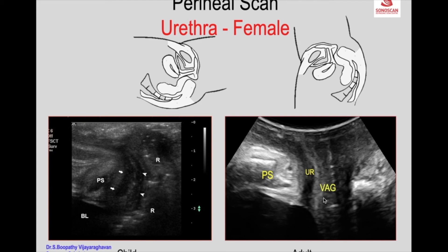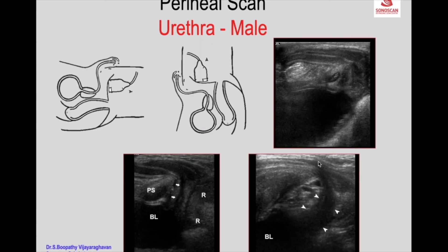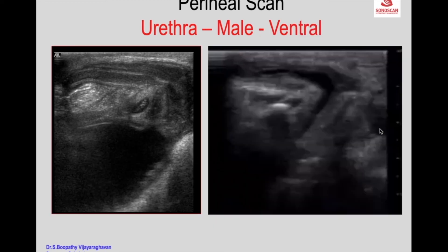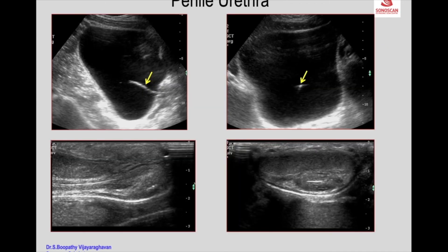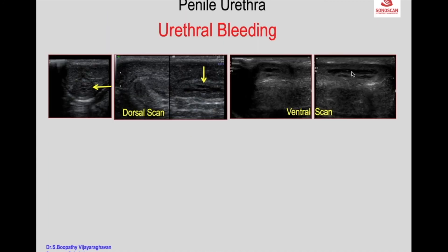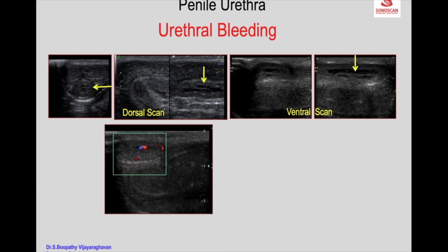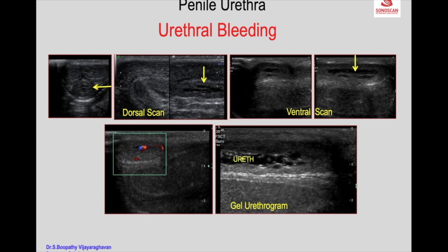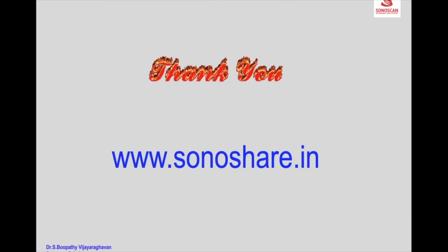The mucus in the vagina gives it an echogenic appearance with an echopoor wall in a child. Here you see the bladder and the structures: the pubic symphysis, bladder, rectum, and urethra. It was a thin leaf of a plant which had been introduced, causing pain. The ventral scan confirmed the same, and on color Doppler showed flow indicating it is a hemangioma, also better seen on gel urethrogram. You see the urethra and the hemangioma of the walls — this is a hemangioma of the penile urethra resulting in urethral bleeding. Thank you for your attention.